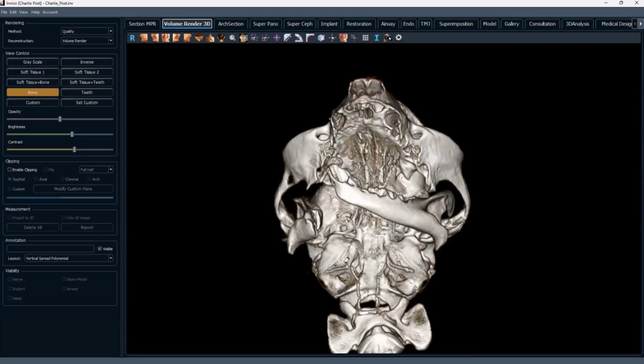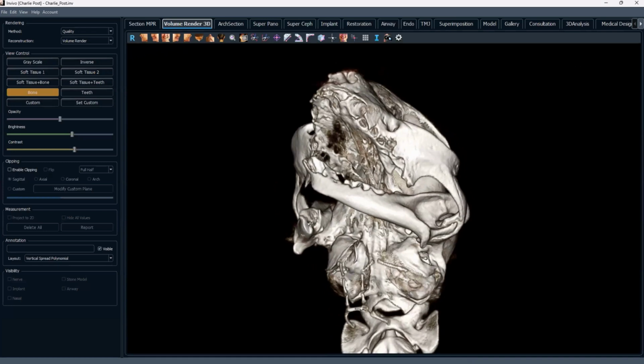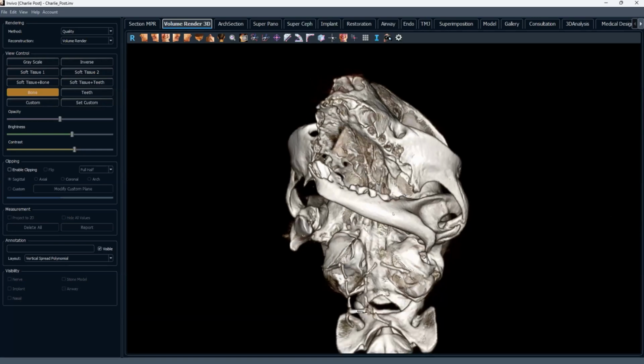But now we can see, we went through the mandible right behind the molar. Turns out he did have a little bit of a mandibular artery left. It was pretty atrophied. It was small, and fortunately, it was kind of the last thing we went through right after the section came loose, so it was pretty easy to manage the bleeding.